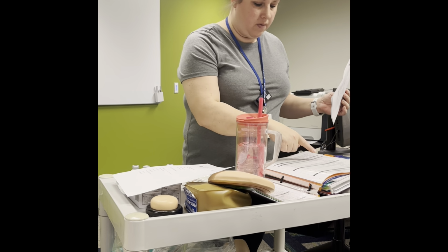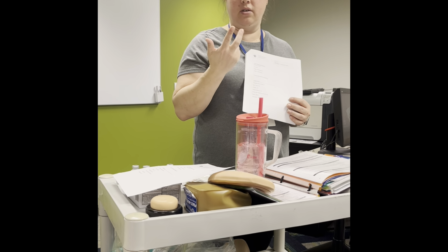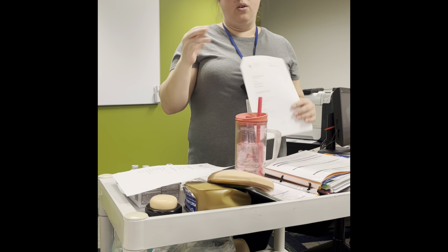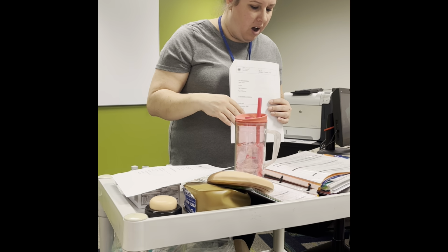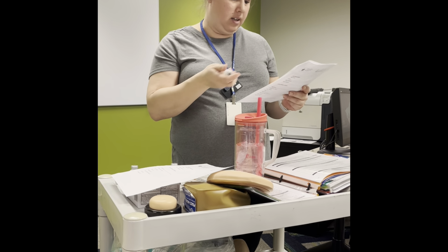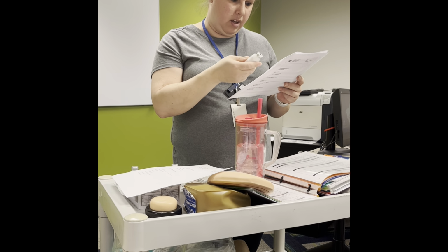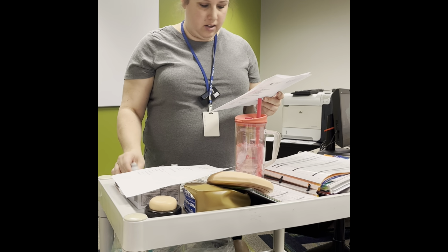Okay, so we've done the expiration, we've calculated, give me your 6 rights: person, dose, drug, time, route, and documentation. Gather our stuff, we have some needles, you'll have some cotton balls. You can say you need a Band-Aid, I'm not gonna grab any Band-Aids, because we're not really actually giving it. Then we would compare the medication using the 6 patient rights again. So again, we have insulin. I'm going to be giving 7 units. I have medication in the vial, subcutaneous with meals, expires 12/2026.